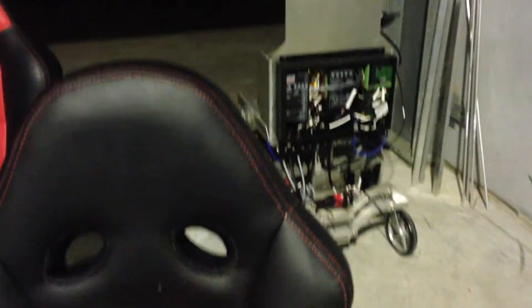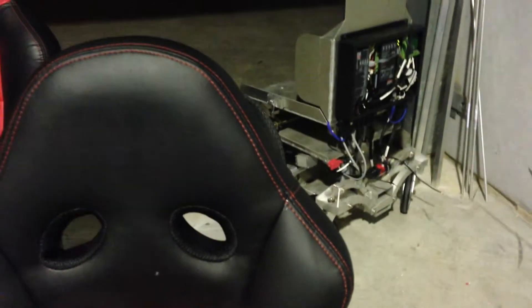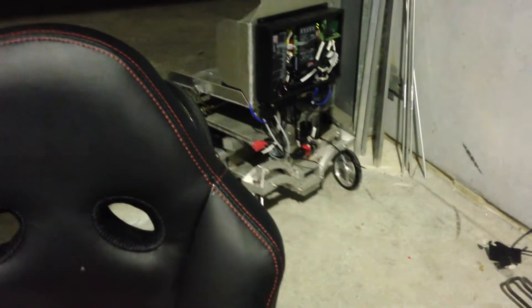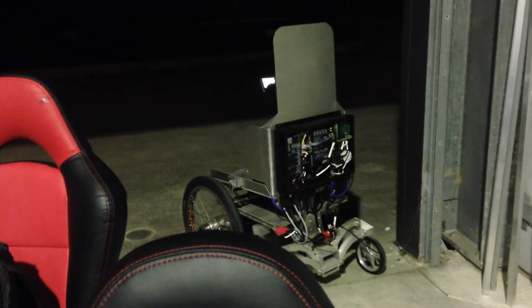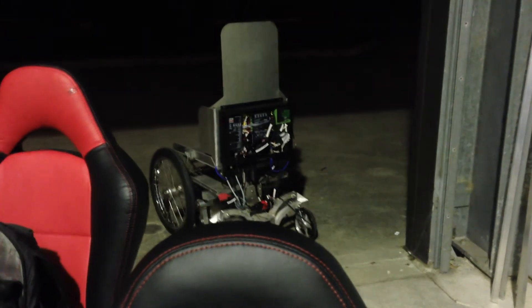Off he goes. Nice slow control speed, remotely controlled outside.